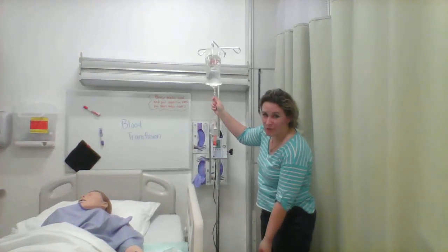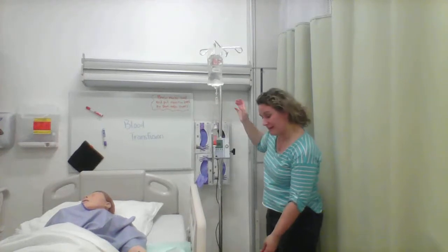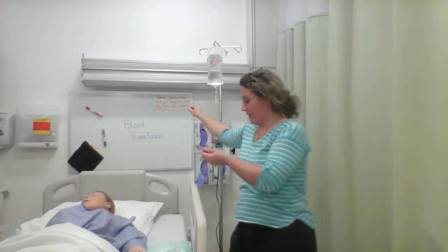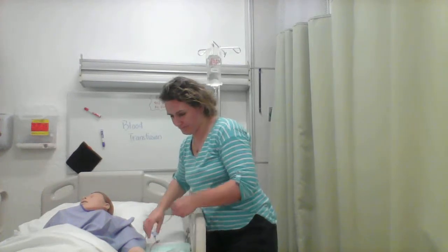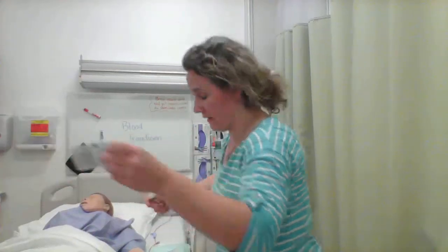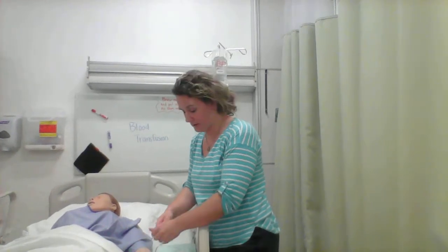Okay, I was trying to get all the water, the red out, but it's not going to go out. So the saline is primed, and I'm going to go ahead and lay this next to the patient. The cap would be on. And before I administer, I'm checking the IV and making sure that the IV doesn't have any redness or swelling around the site.